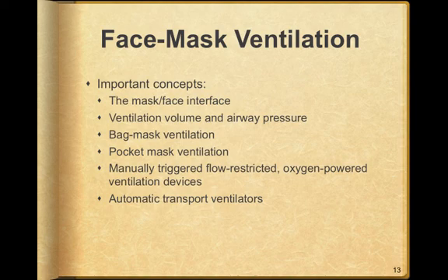Bag mask ventilations, you have to be sure that your ventilations are going in and that they're going in correctly. There's a couple ways to do this. We can use a two-person technique, in which one person essentially isolates on the mask and makes sure that it is sealed and the other person ventilates. Or we can do a CE method. Now that requires a big hand. The C goes around the mask, and the E grabs the lower jaw and pulls it up into the mask.